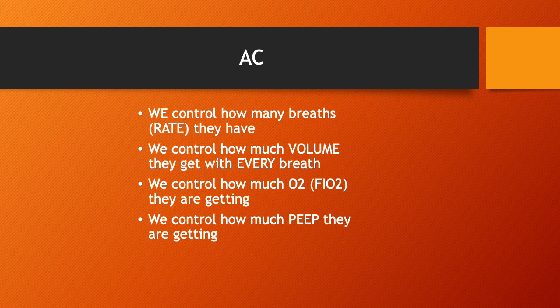So this is very similar to CMV, which is why a lot of times CMV is not used anymore. But this mode effectively gives clients an opportunity to take their own breaths and get a lot of that extra support. Maybe they still need that extra volume. Maybe they're still weak and still working on trying to take bigger breaths. So this is a very supportive mode, and usually one for someone who still needs that support, someone who's still recovering from whatever reason they might be on the ventilator in the first place.